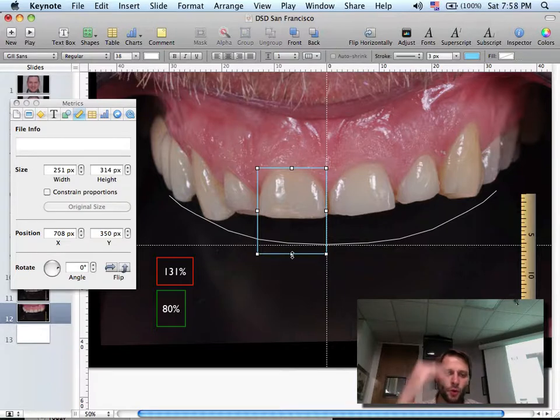So now if we don't want to move the gingival margin, the other analysis that I can do is, what is my limit? And I mentioned about 70%. If you give a 70% proportion to the technician, he can play with the line angles and still create a nice central. So from 70 to 90%. Actually, I want to go higher, 90%, I'm sure. Sorry. So how do I analyze 90%?